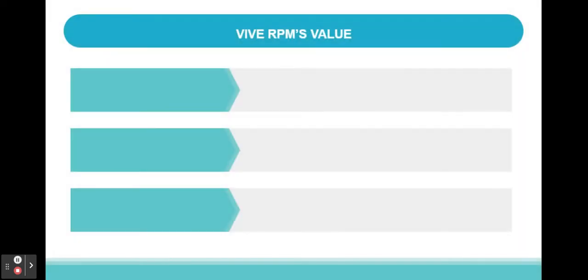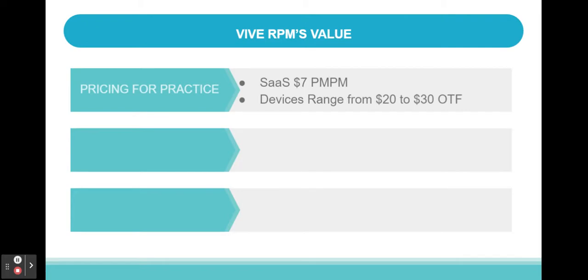When creating Vive RPM, we wanted to help healthcare providers effectively address prevalent issues in the industry. With our affordability, practices can reduce the cost of care for payers and providers.